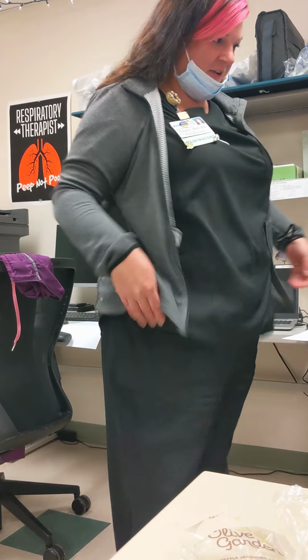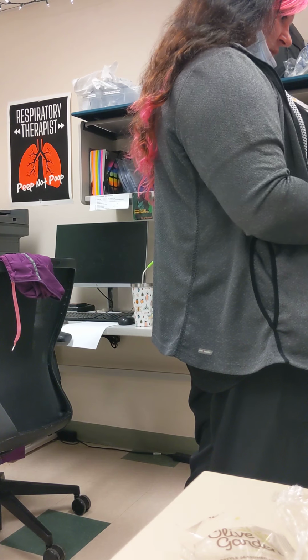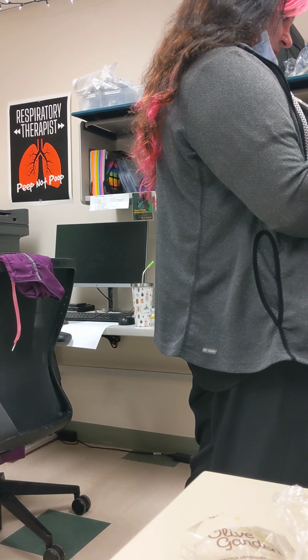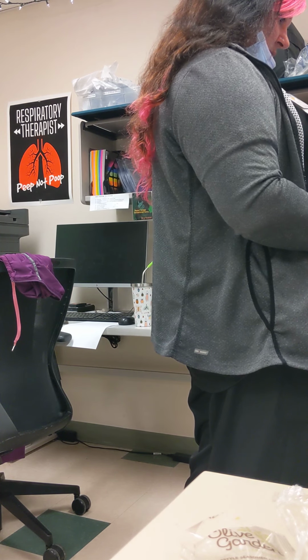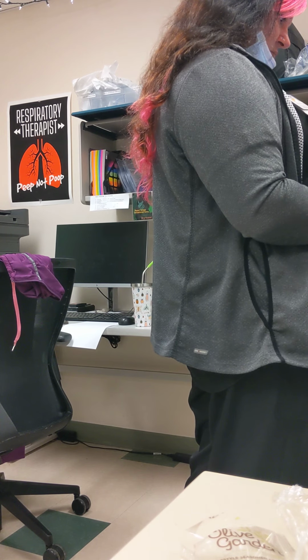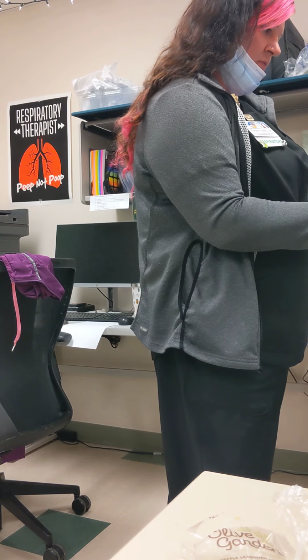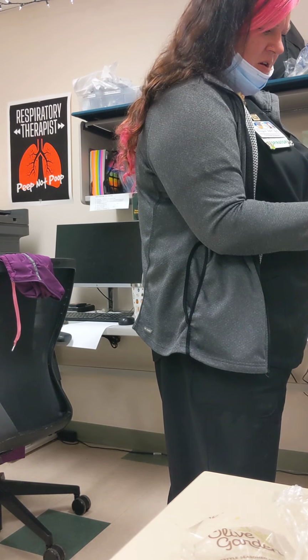and then there are 3 different activity modes. Low, they just need a little volume support. Medium, maybe they want to do their laundry and they need a little more support. They're going to take the dog for a walk or go to pulmonary rehab, we can set a higher support. And our RTs go out and do this. They'll titrate the patient on the device. Or if you have a patient in-house you want to try on it, that would be me, I would come and try it on the patient.